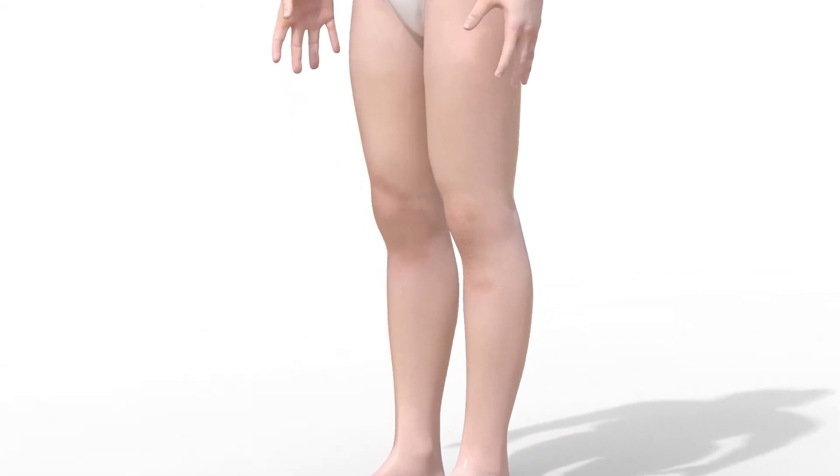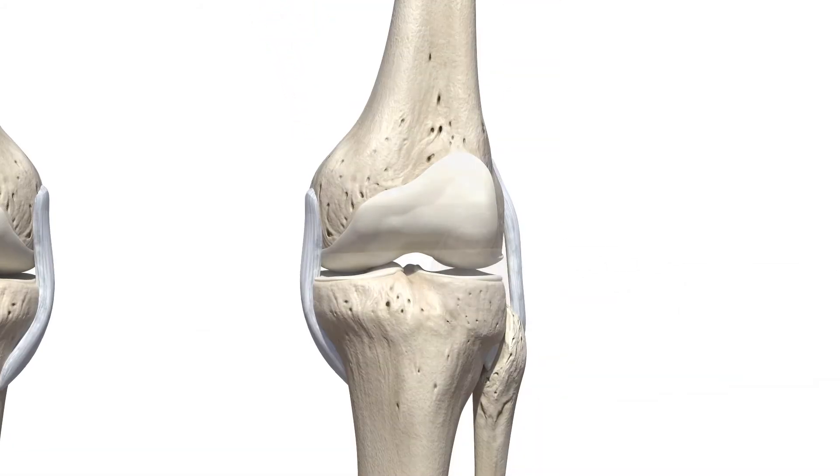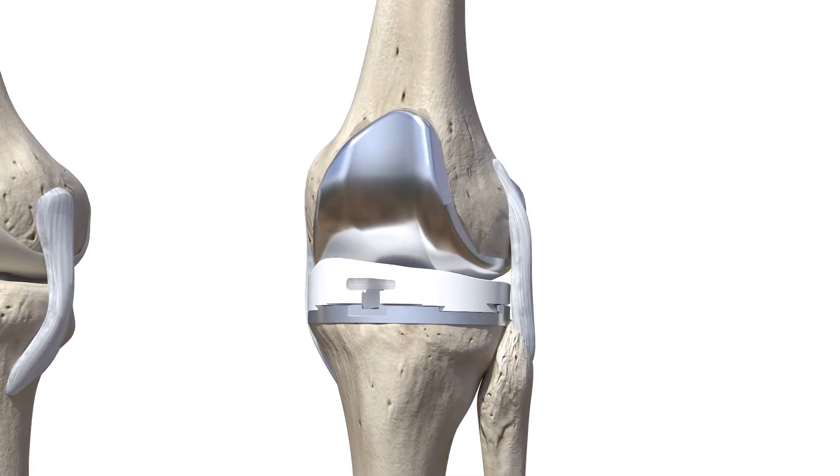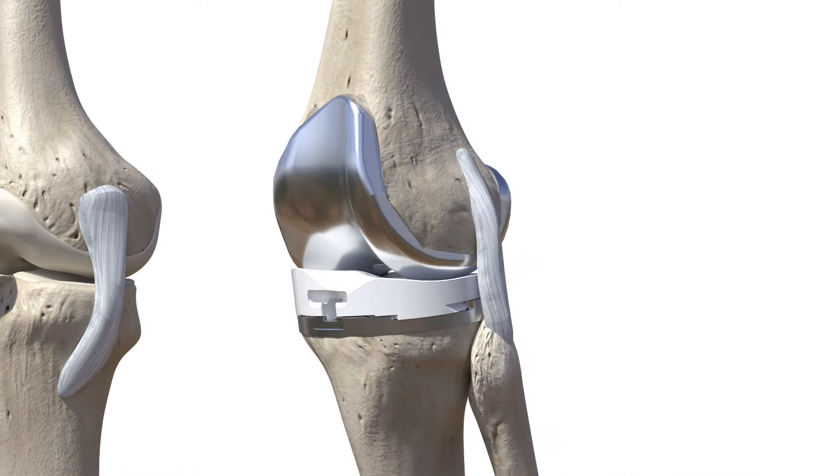A total knee replacement is designed to mimic the feel and function of your natural knee. Because every patient's knee anatomy is unique, knee implants and surgical methods vary.